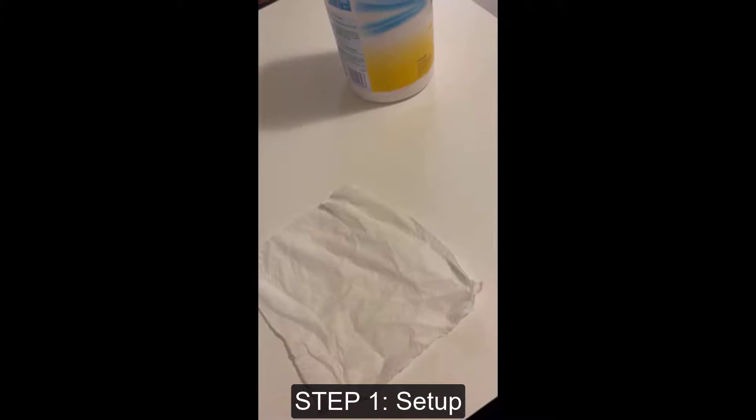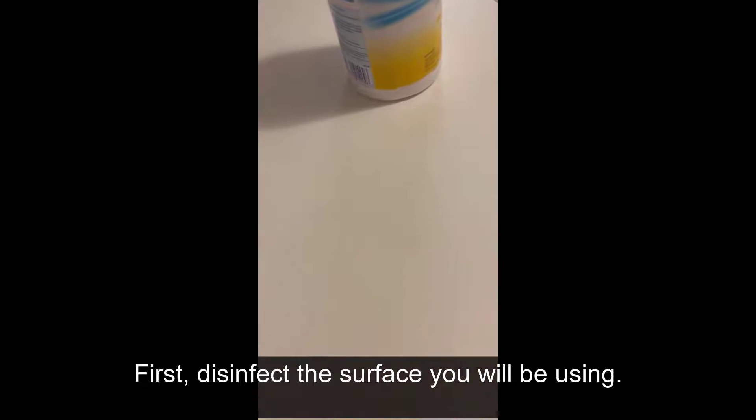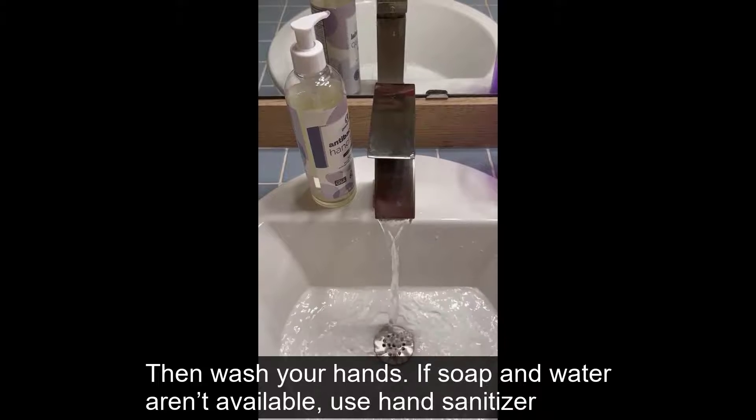Let's begin the test. Step 1: Setup. First, disinfect the surface you will be using. Then, wash your hands. If soap and water aren't available, use hand sanitizer.